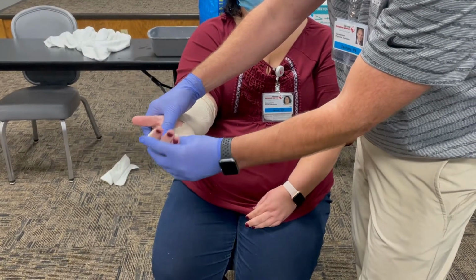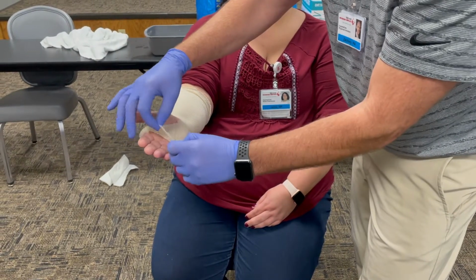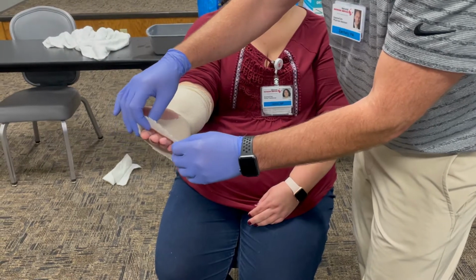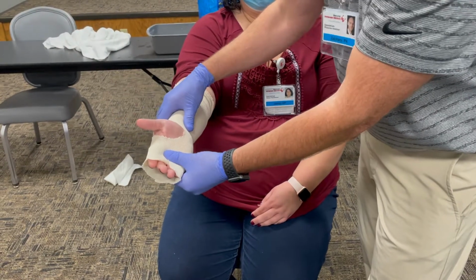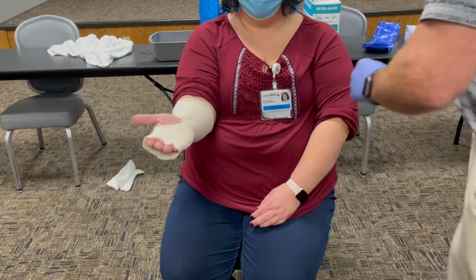They should be able to flex their fingers unless you're trying to immobilize a proximal phalanx fracture. But if you did that, you'd have them in a radial gutter or ulnar gutter. So just for a distal radius fracture, you're only coming down to about that crease. All right, so we'll do our padding.